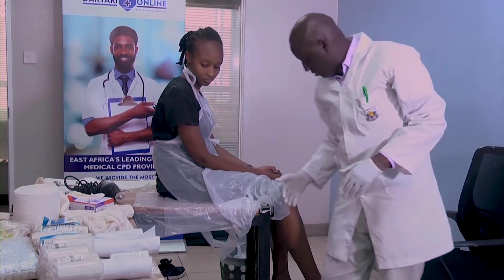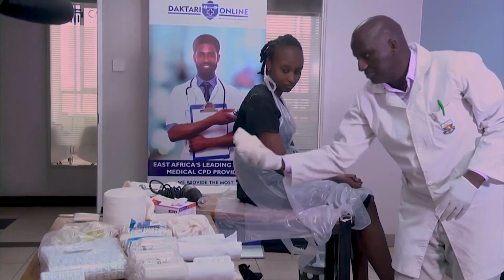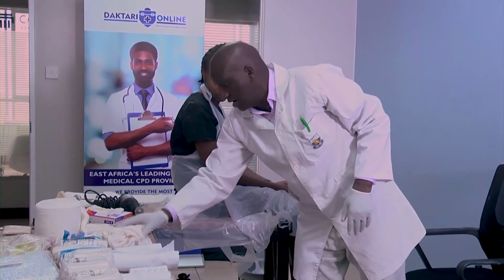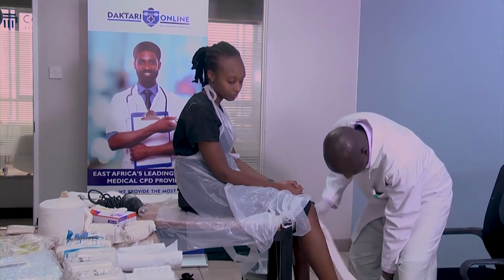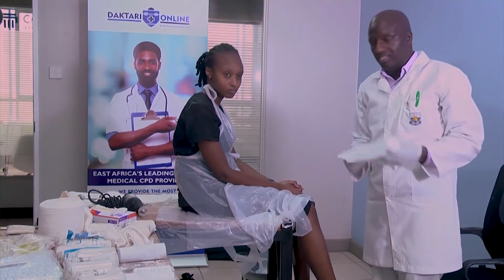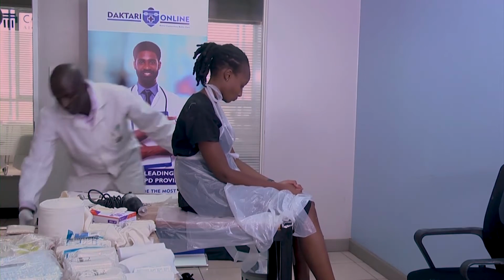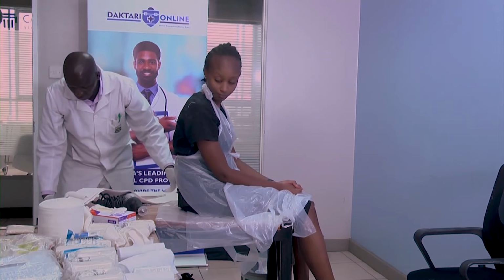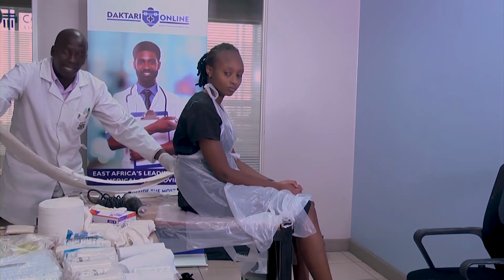So what do we need when we want to apply a below knee posterior slab? Of course, our materials are very important. We'll require crepe bandages of various sizes, especially 6-inch. Then stockinette is very important, and we measure and give it all the way so we can see it. Then the orthopedic padding is very important. Then we measure our two slabs: the posterior slab, and then the other for the lateral and the medial, like a U slab.